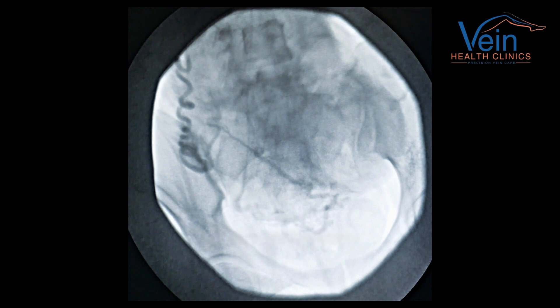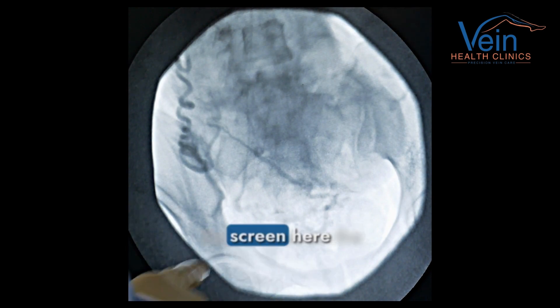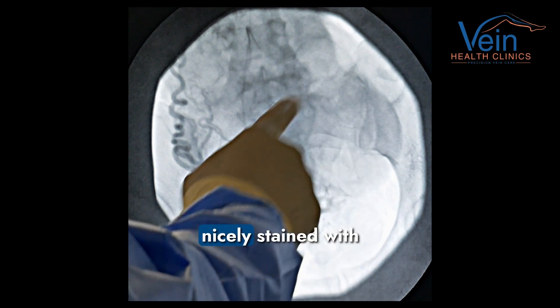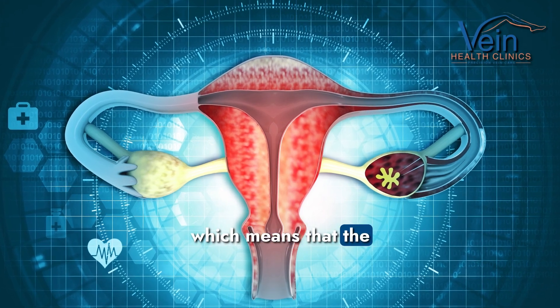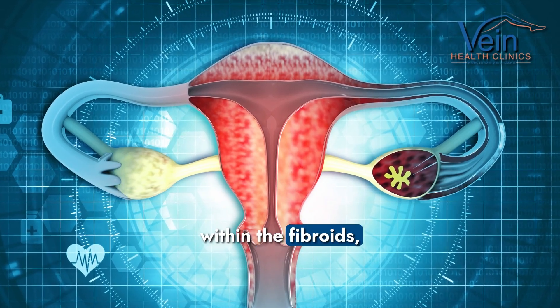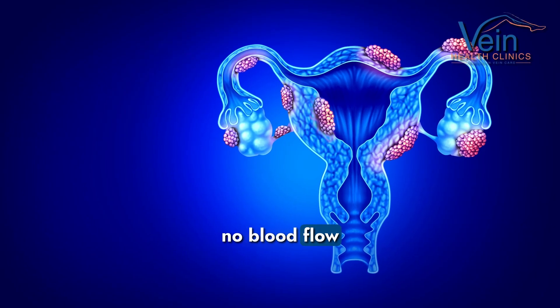Now we're at the conclusion of our procedure. You can see on the screen here that the fibroids are really nicely stained with contrast material, which means that the particles we put into the fibroids are nicely within the fibroids and they really have no blood flow anymore.